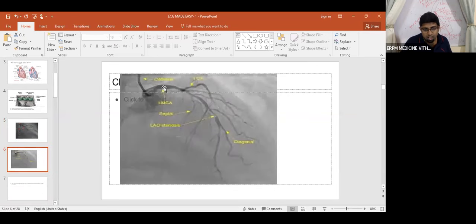So here, look. This is your catheter, and this is your wire. You take the catheter and inject the dye into the left main coronary artery. So you can see it nicely here, because if there is a block here, I'm worried. Left main coronary artery block is one of those places where, instead of sending the patient for stenting, sometimes we go to surgery directly. You will refer the patient to the cardiothoracic surgeon for CABG bypass.